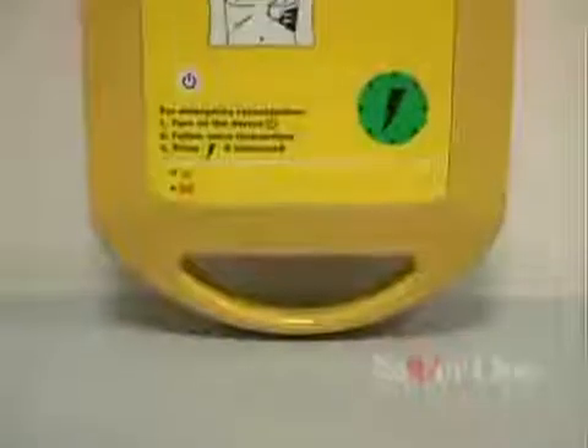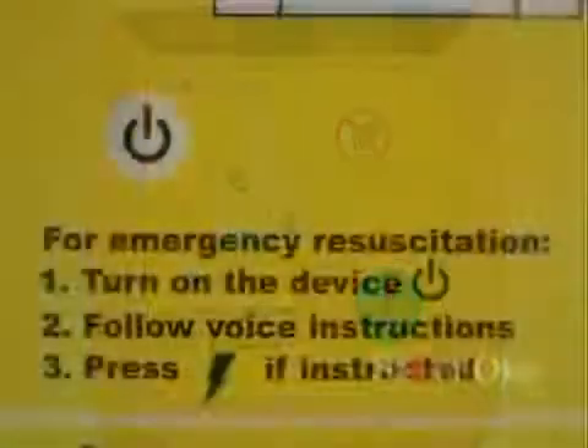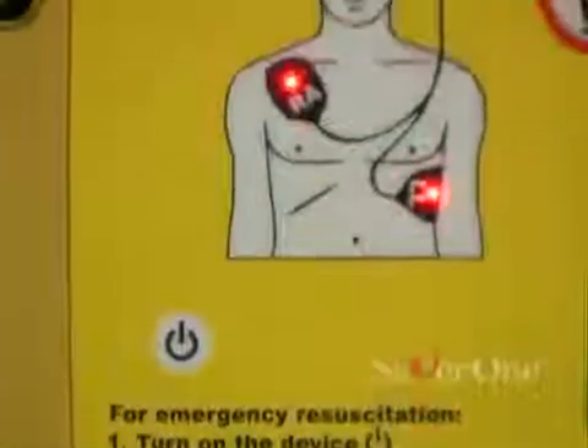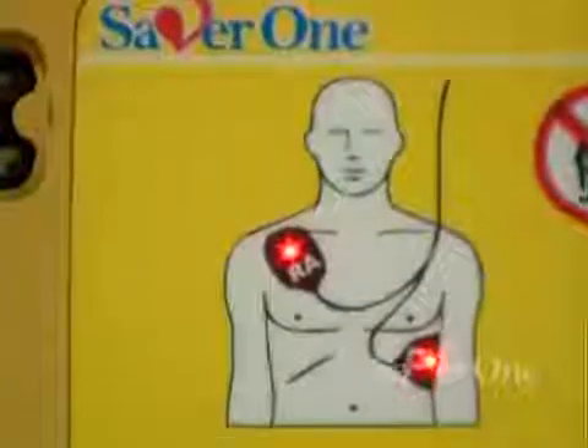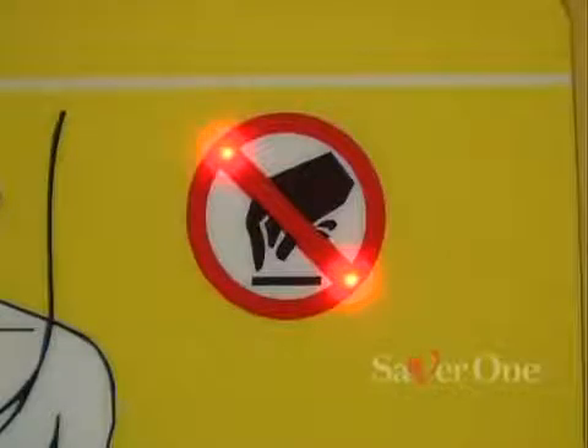The Saver One is an intuitive, easy to use device. It has only two push buttons: switch on button and discharge button, which glows when ready to defibrillate. Plus a flashing icon which instructs the operator in connecting the electrodes, and a flashing icon indicating the operator to move away himself and anyone from the patient.